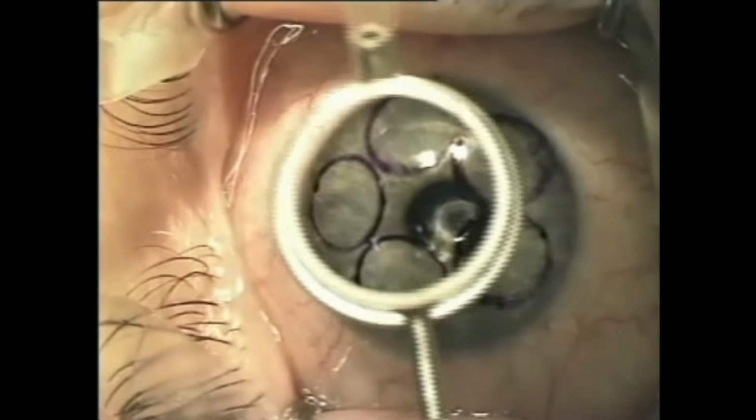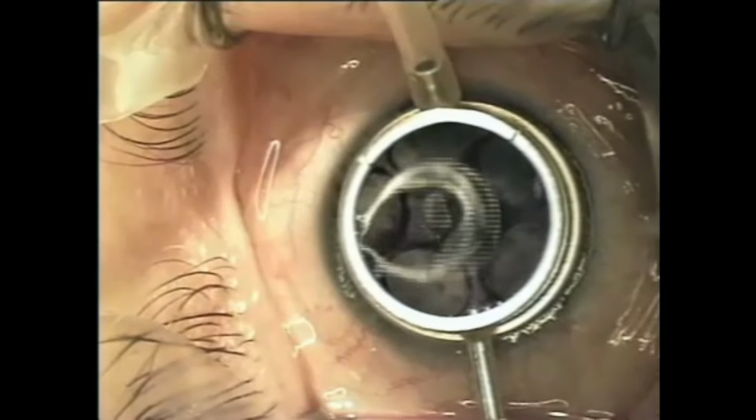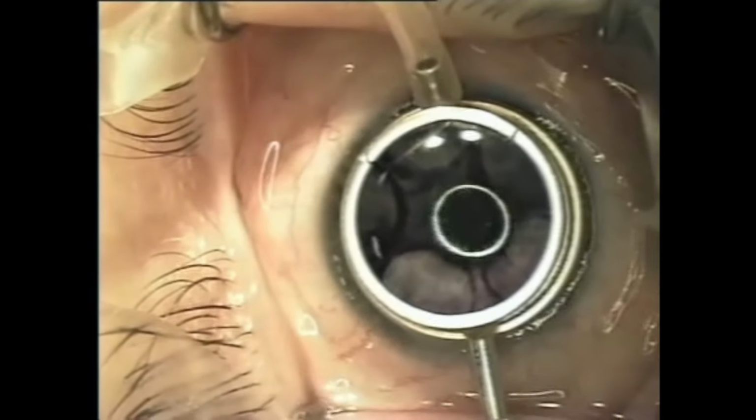In summary, laser epithelial keratomileusis, LASEK, is a technique that may be an alternative to laser intrastromal keratomileusis, LASIK, especially in lower myopes and in patients who have predisposition to trauma.